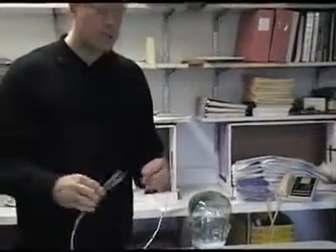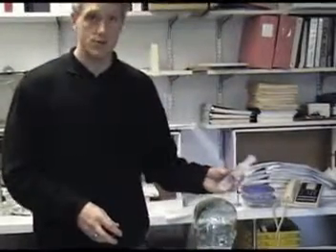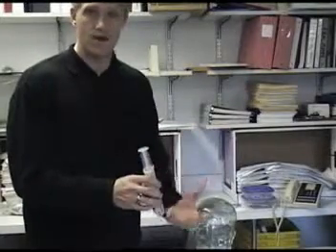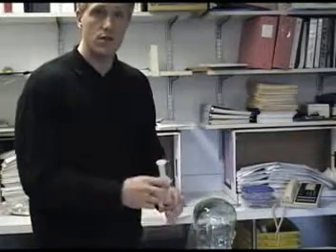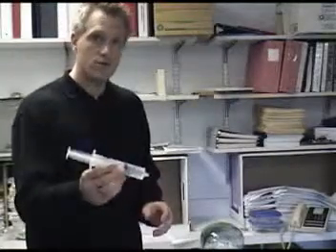Now, if you'll recall, we had also drawn up another syringe. If by any chance you don't get that first sample back, for some reason the patient's very dried out and it is absorbed very quickly into the lower lung, you now have another syringe with which you can do a lavage and aspirate right back very quickly. So if you do the first 40 cc's and you can't get a sample back, you've got another syringe that you can put another 40 cc's in and aggressively try to get the sample back.